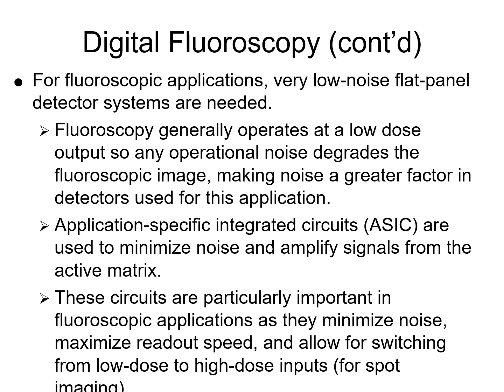In screen film, there was only one source of noise, and that was the Compton scatter. But now that we've converted the image into electronic form, computer circuit form, computer data form, it's subject to electronic noise too, in addition to X-ray noise, which is Compton scatter. Okay, and so the noisiness of detectors is a factor.